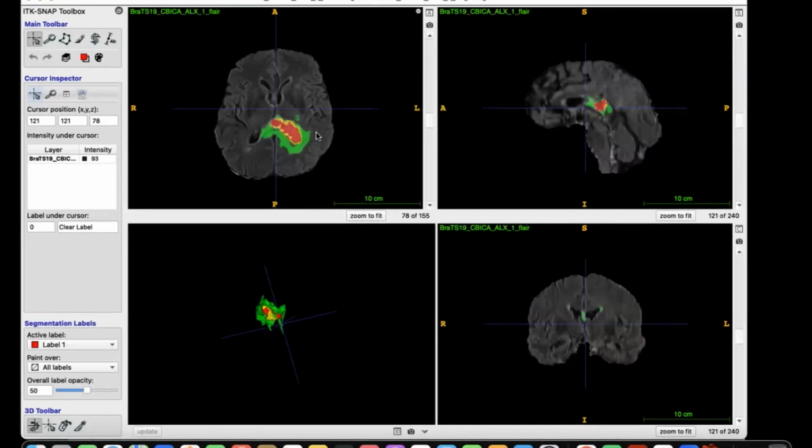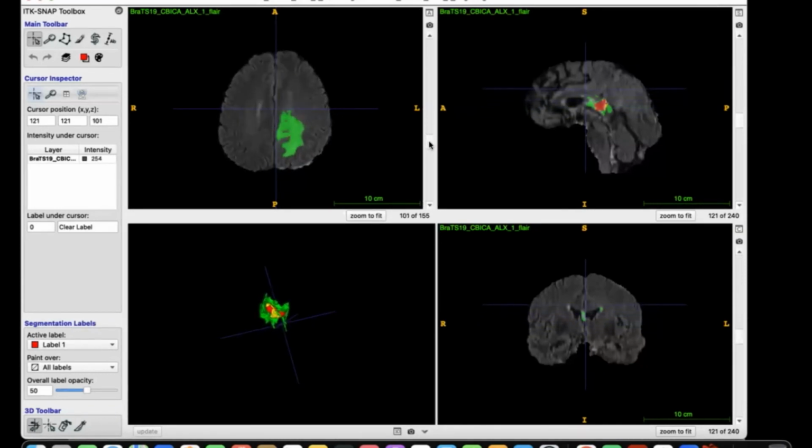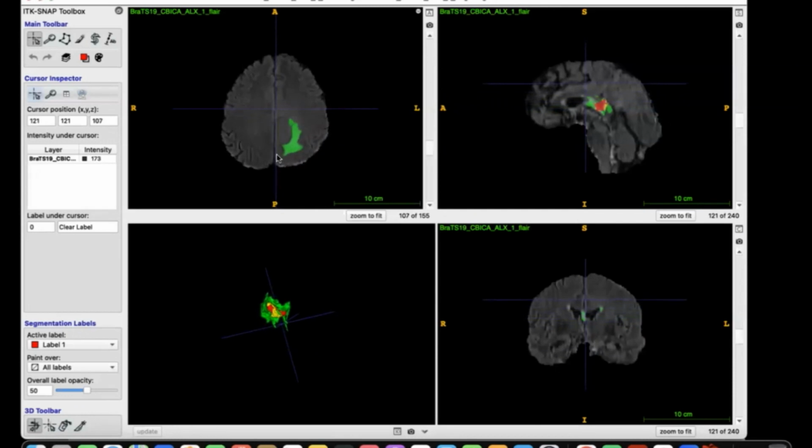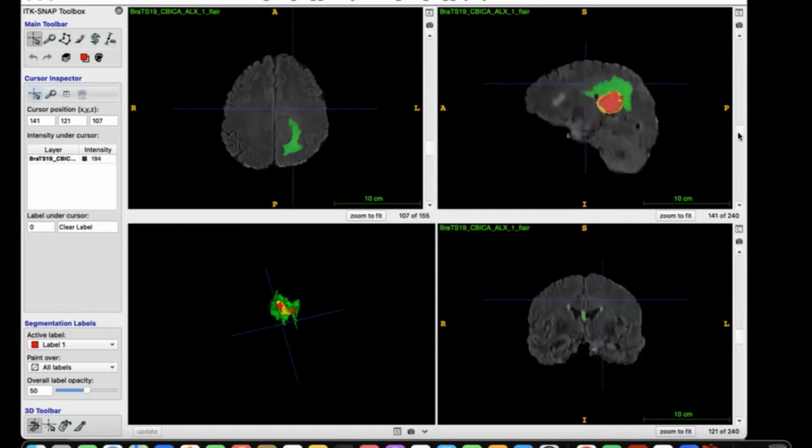Some of them overlap, very intricately together, and don't have a clear boundary. And you can also check out different slices, right? Some of the slices don't have all the tumor types, maybe only one, because in this slice those tumors do not show up. So you can also do this for other views.